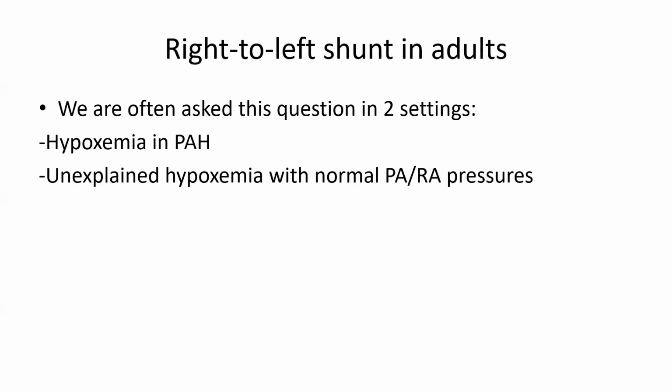Let me talk here a little bit about right to left shunt again. I explained how to diagnose right to left shunt earlier, but I want to explain the types of right to left shunt we encounter in practice and how to diagnose them in practice.